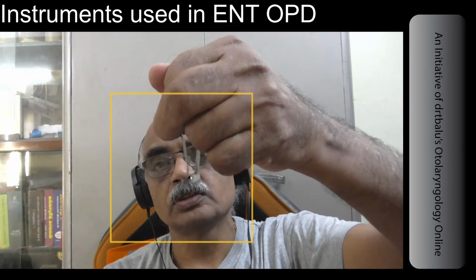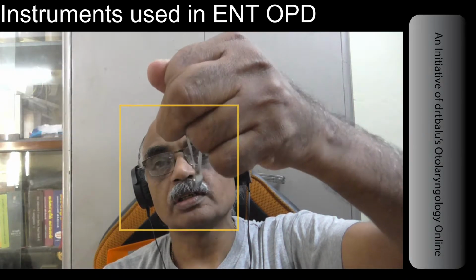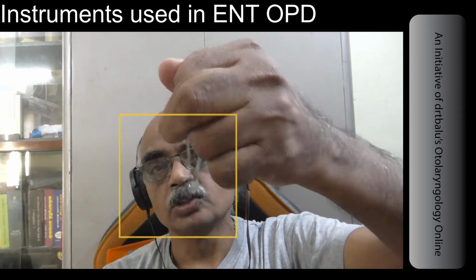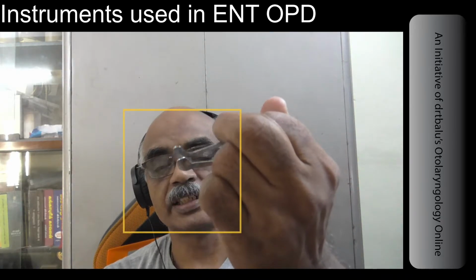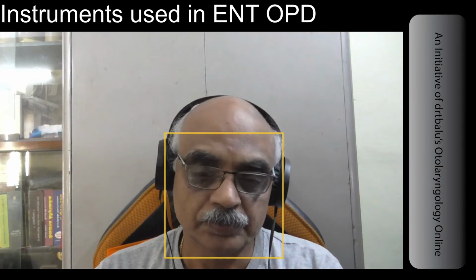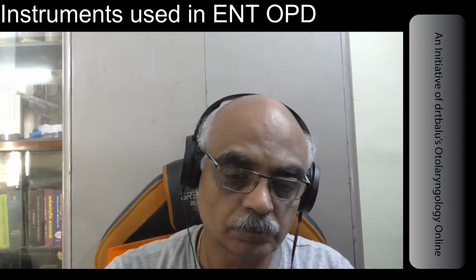This is how you hold the Thudichum nasal speculum and use it to retract the ala and to examine the nasal cavity completely.